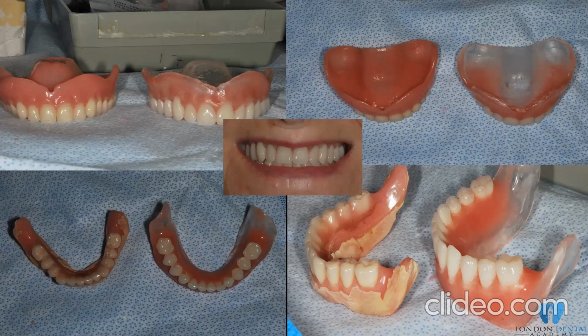And that might also indicate, unfortunately, that you might have a lack of interarch space, meaning that you have a problem with your OVD. So try to get the best you can from your wax try-in. Agree everything and ask the patient, do you need anything more? Are you happy with the denture?